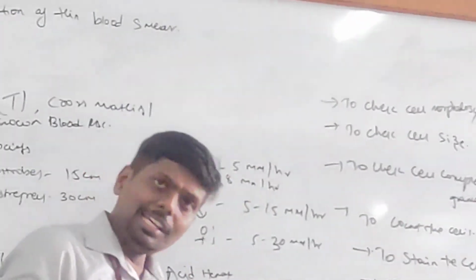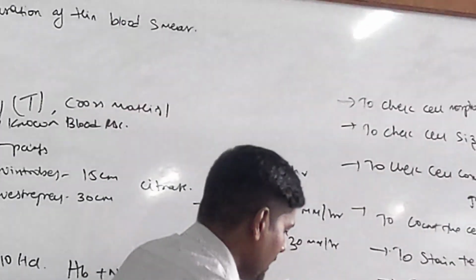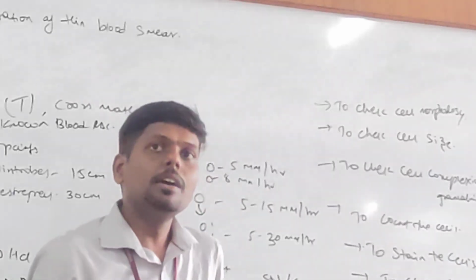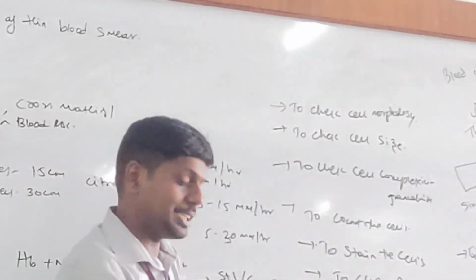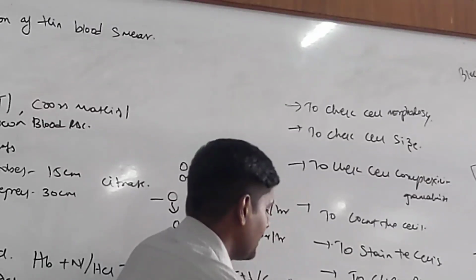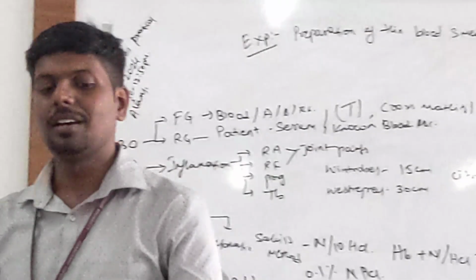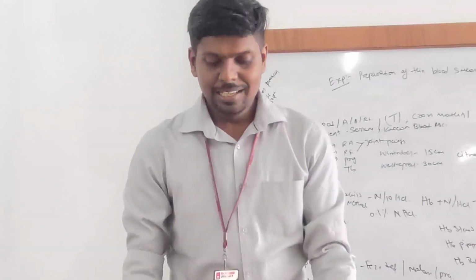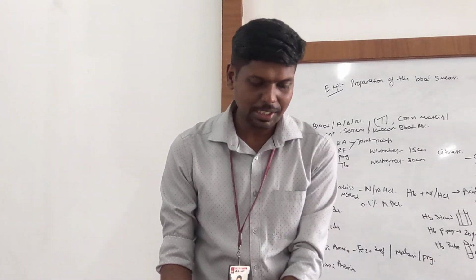But now in the cytoplasm we have acidic granules and basic granules. Acidic granules will be in blue color and basic granules will be in pink color. Is it true? Let me cross check. One second, wait. DLC.